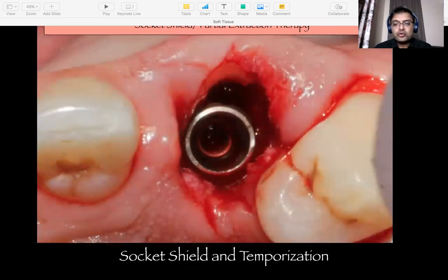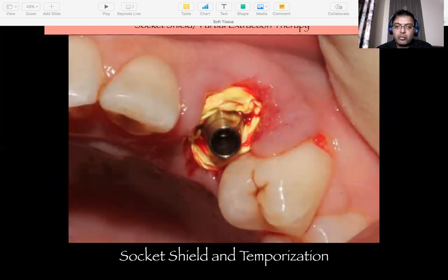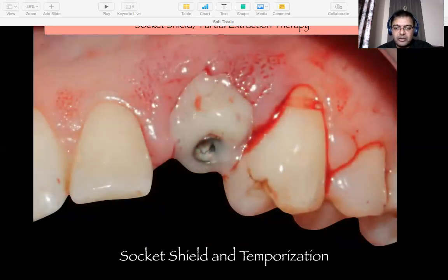And when I'm leaving this root piece there, the labial shield, what I am doing is that my entire labial tissue here is gingiva and not peri-implant mucosa, because I have the cementum, and I have the periodontal ligament fibers attaching onto the cemental surface. The peri-implant mucosa is only on top of the mouth of the implant. So then what I do, I put a Teflon there, I put a temporary abutment and customize the healing abutment and leave it. My patient goes back like this.